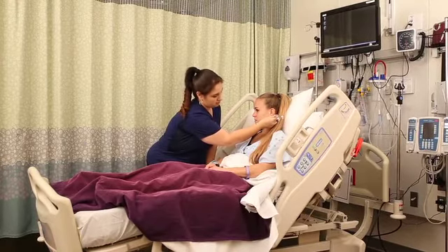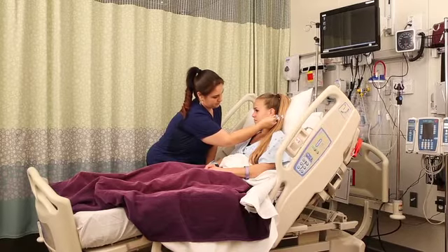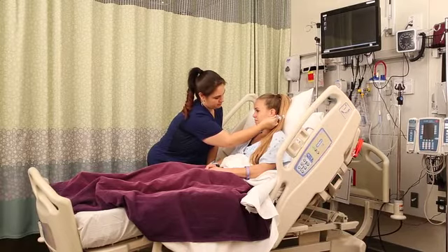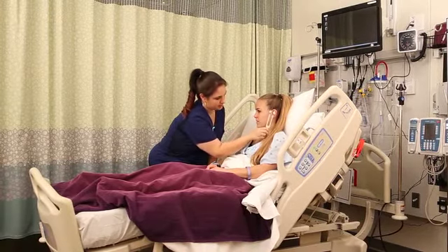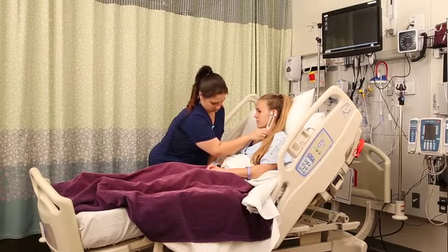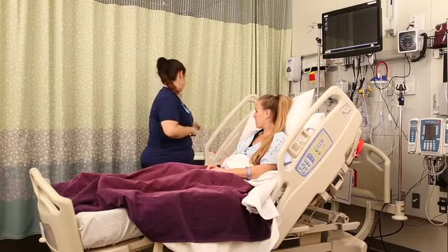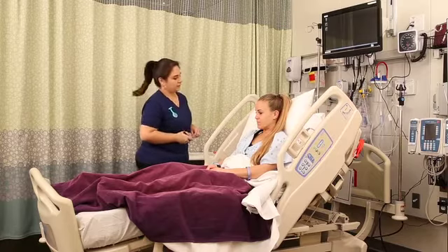Have the patient let you know when they can't hear the sound anymore. Now, I always do this on my hand and not a table so that the sound doesn't go on forever. Once they say they can't hear it anymore, you're going to take the tuning fork and move it to right outside their ear without touching it, and again have them tell you when they can no longer hear the sound. This test compares air conduction and bone conduction. The second test, the air conduction, should last about twice as long as the first one, the bone conduction.